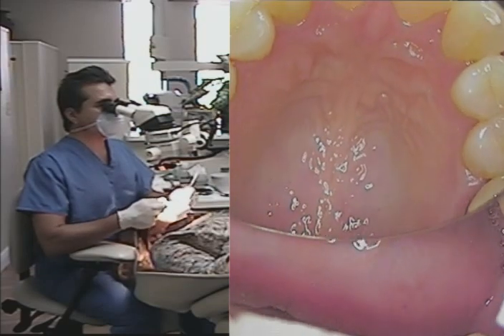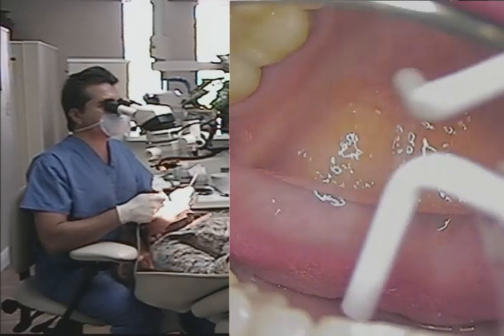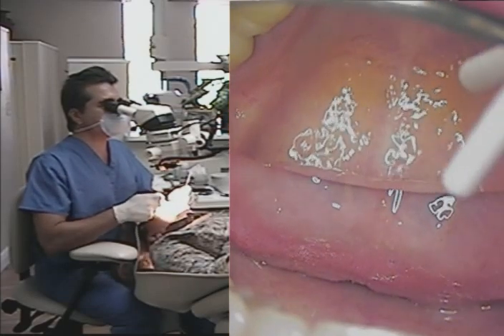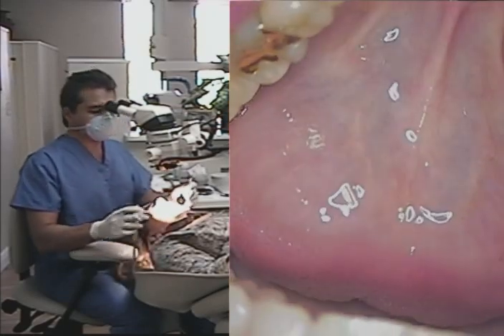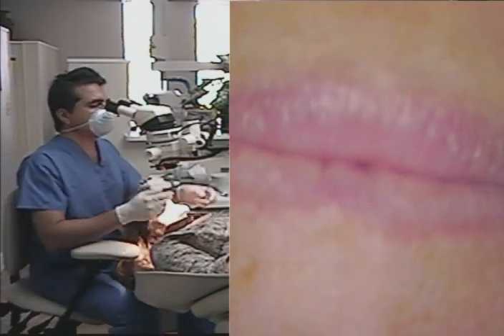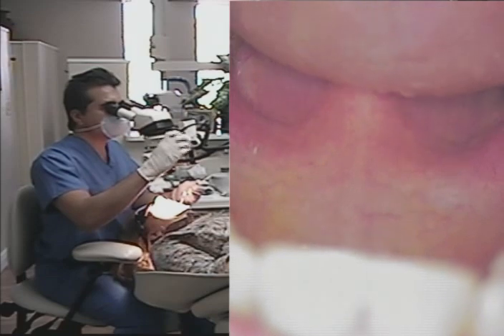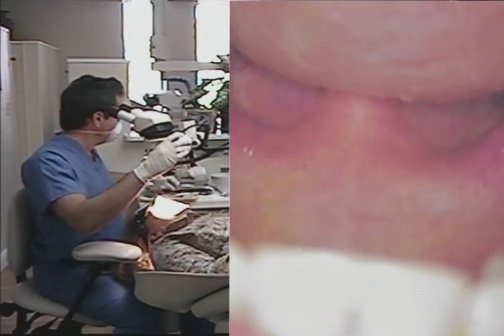I just want to discuss a little bit about doing an oral cancer screen as well, using a microscope. It's a great way to check the throat. Phyllis, what I'd like you to do is try to raise your chin up as if you're looking behind your head. Perfect — now open as wide as you can. Alright guys, here we go — we're going to take a look at your throat.